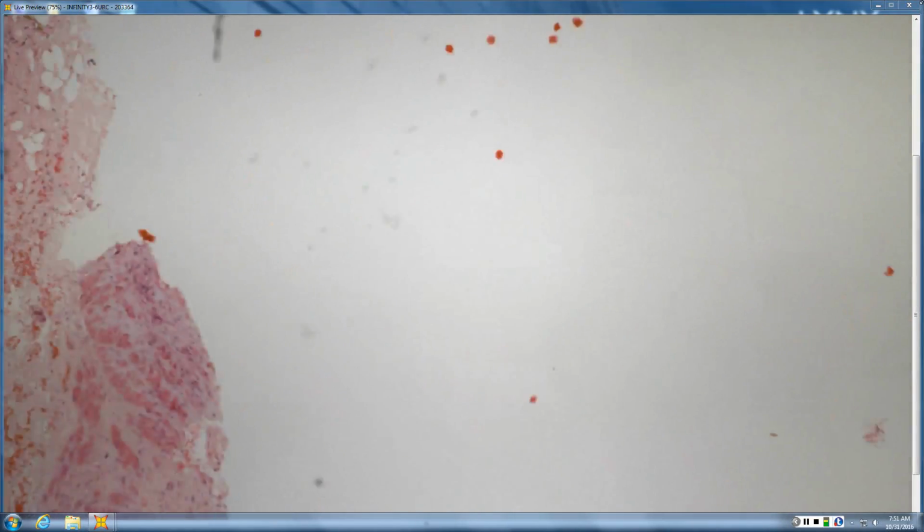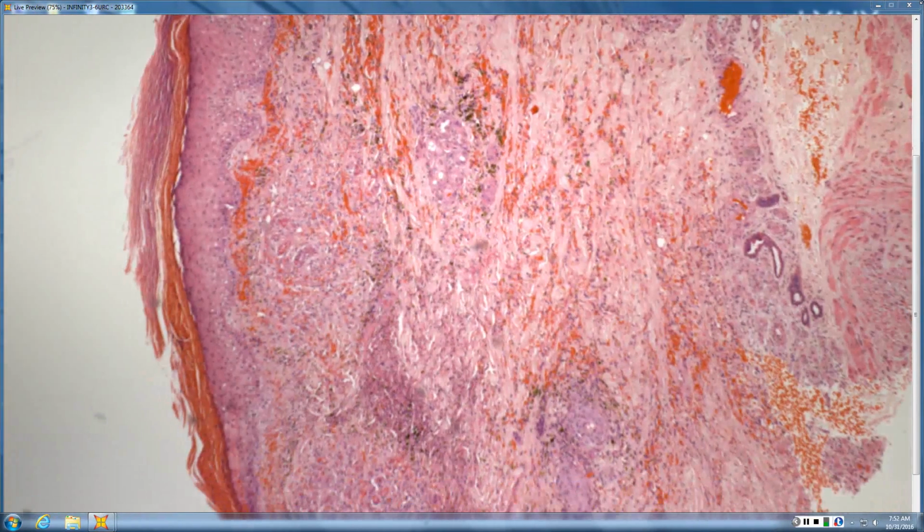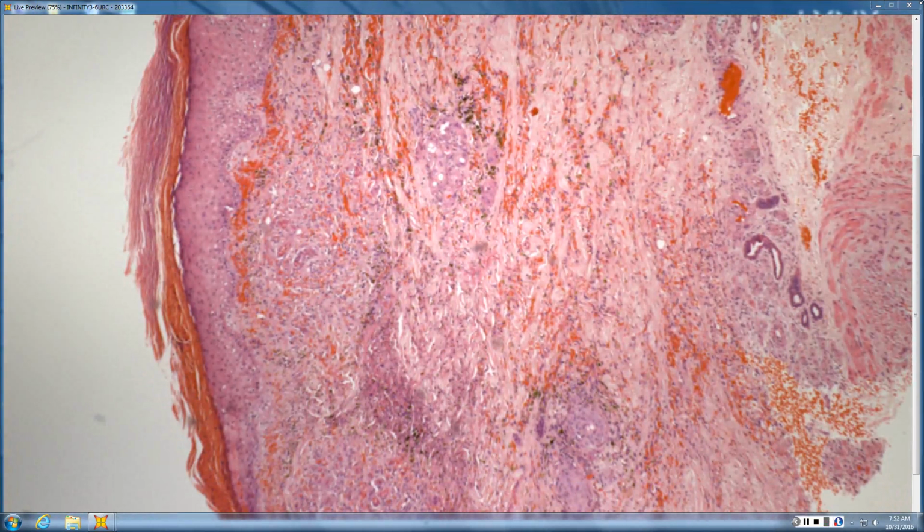Yeah, I was thinking of livedoid vasculopathy. Livedoid vasculopathy looks a little different in that the lumens are tiny, tiny little lumens, always containing thrombi with hyalinization of the vessel. In this case, you have nodular angioplasia, but I don't see thrombi, and the vessel wall is not hyalinized. Okay. So that's stasis rather than atrophie blanche. Atrophie blanche has nodular angioplasia, but the vessel has almost no lumen, and what lumen there is, there's a thrombus sitting there. Okay.